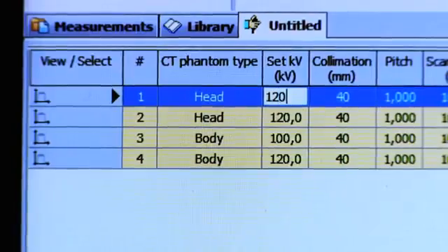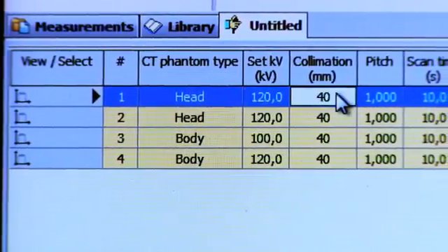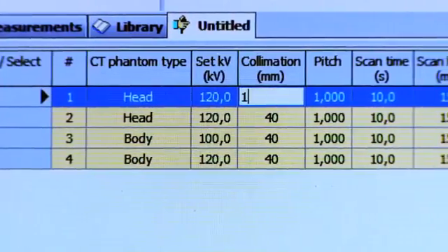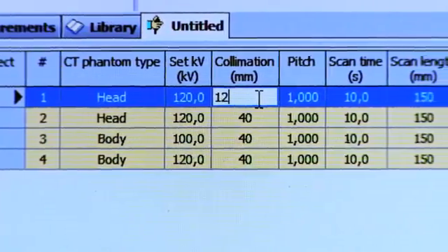Kilovolt. Collimation. This is the thickness of the total detector area used in the CT. Sometimes you have to calculate the thickness yourself.